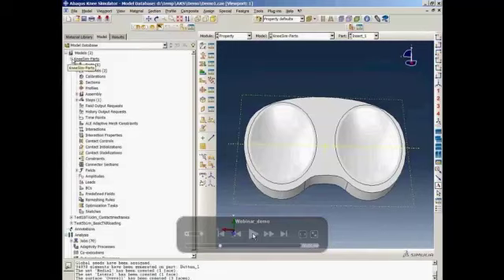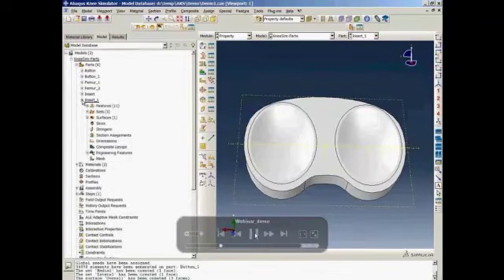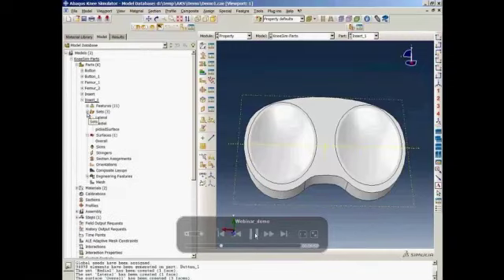As soon as the user changes to another module inside the analyst view, they will have access to the model tree. So again, the knee sim-parts model is where all the parts and materials reside. You can see the parts I have just imported, and all the surfaces and sets created.